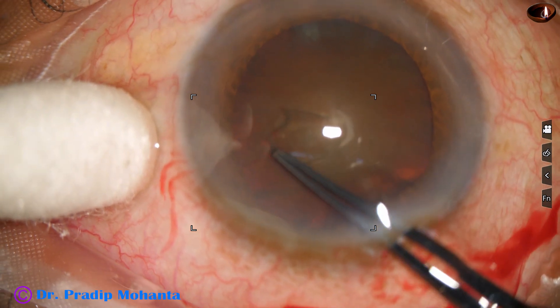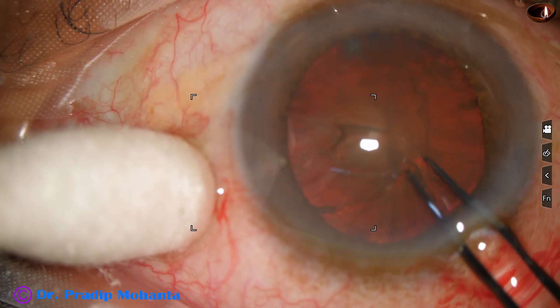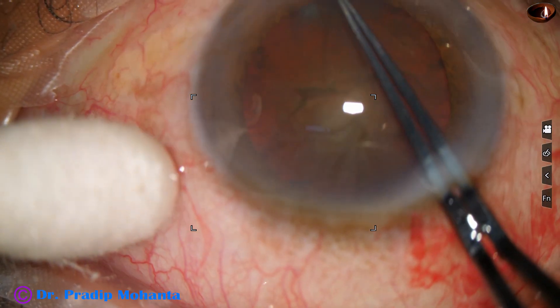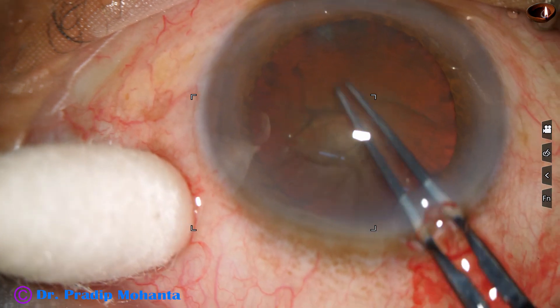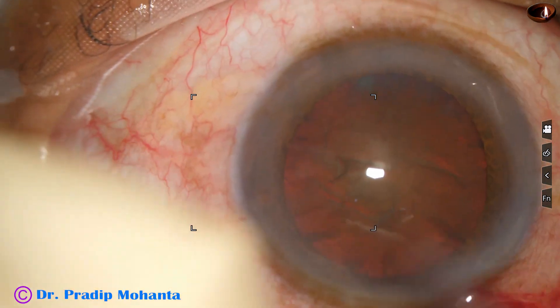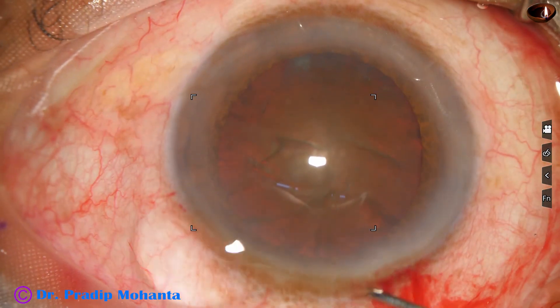I take utrata forceps, raise the capsular tag, hold this tag, and go anti-clockwise to do a large rhexis. Since the nuclear sclerosis is about grade 4, I do quite a large rhexis. The size of this rhexis is about 5.75 mm.